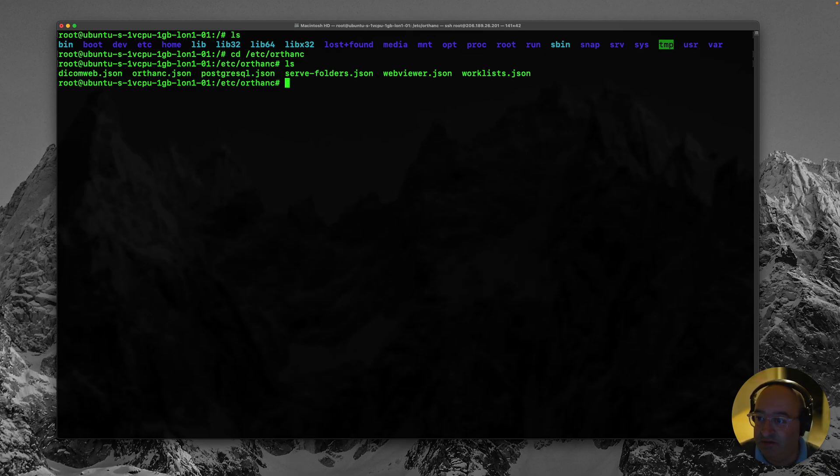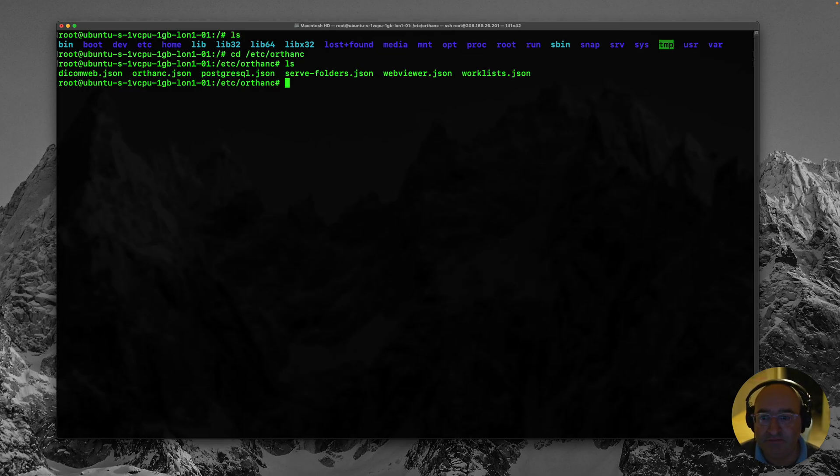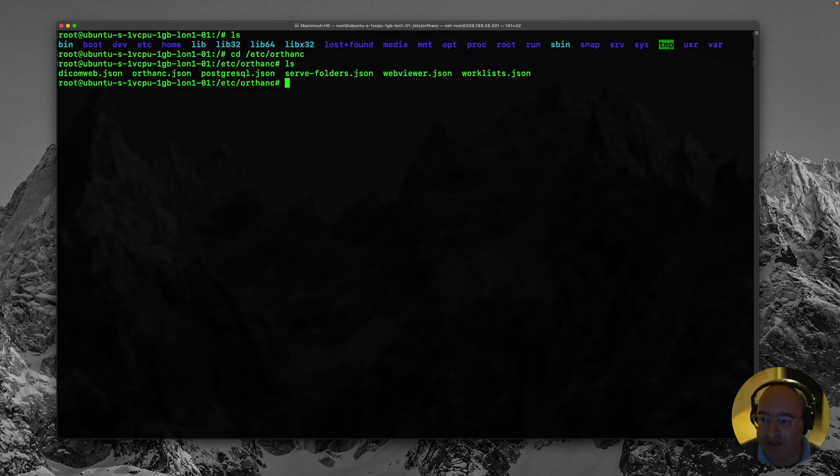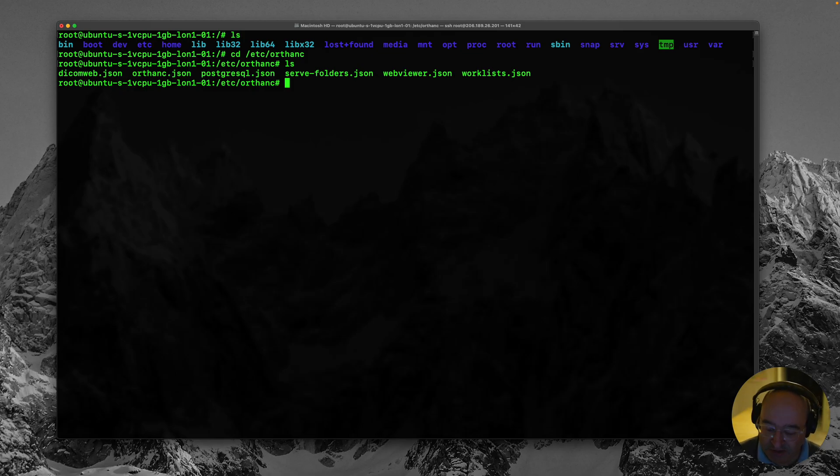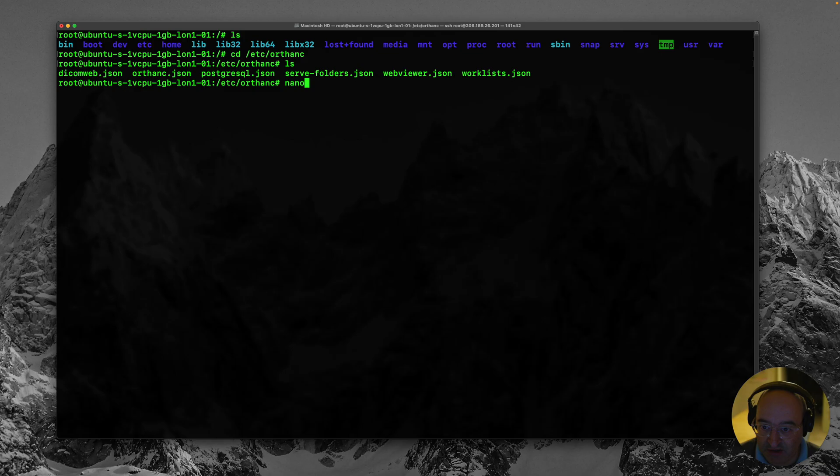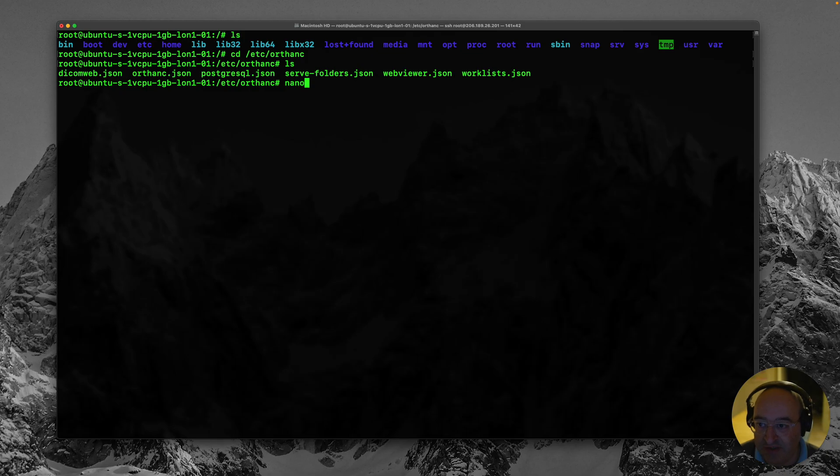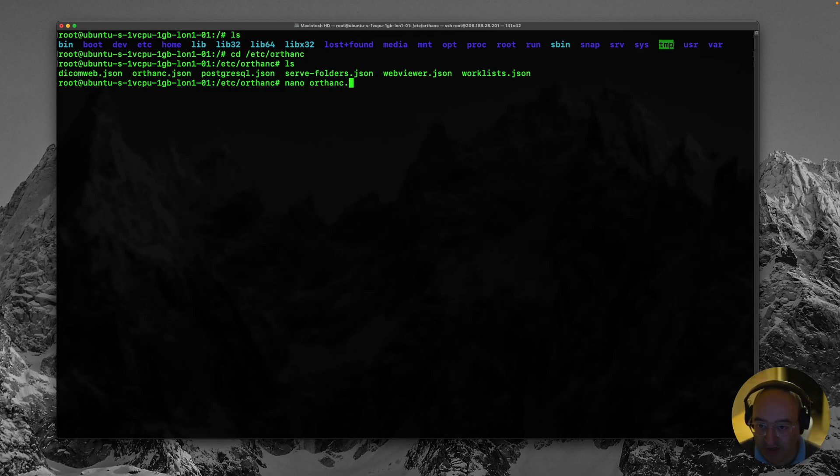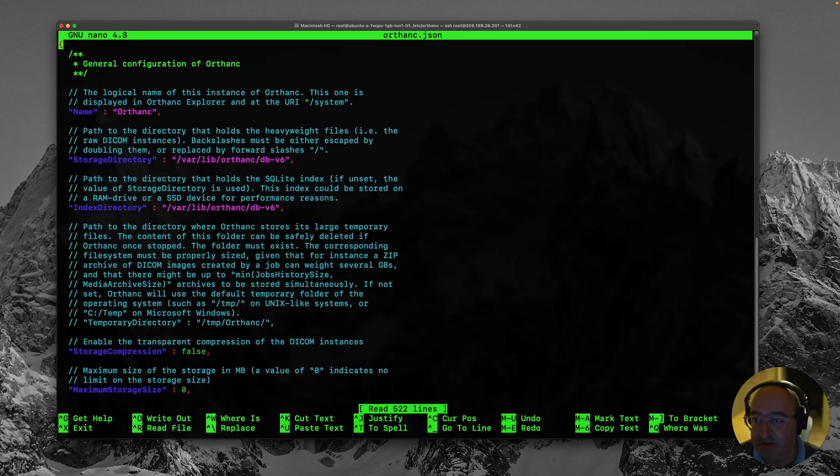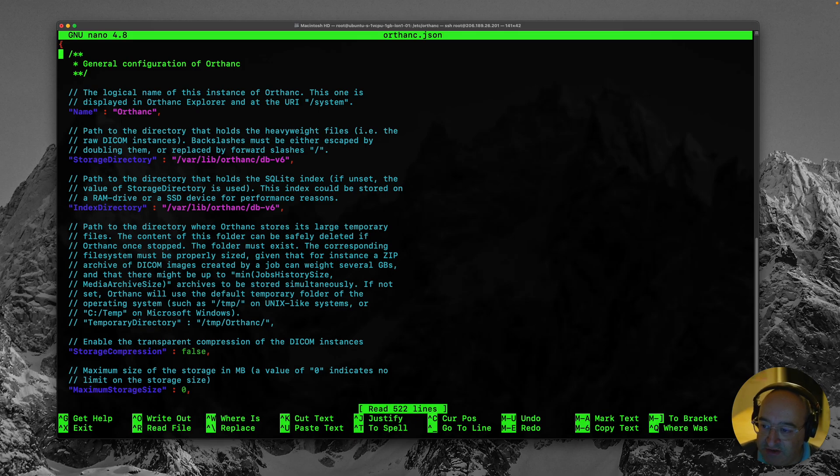They are the configuration files for the Orthanc server. So as far as I remember I think it's the Orthanc.json is the one that we want that has like all of the good stuff in it. So I'm going to now type a command which is nano. And nano is a text editor which is just part of the Ubuntu server installation. It's reliably always there. Nano Orthanc.json to open the text file. And there we go.